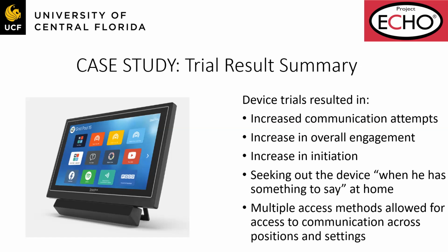He started using eye gaze significantly better on the GridPad 15 than he had previously been using it on the I-12. The I-12 has an older camera that isn't as tolerant of light. Adam's location is very bright, with lots and lots of windows, so I don't know if that is a contributing factor.